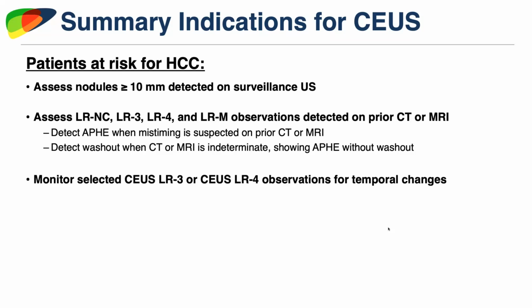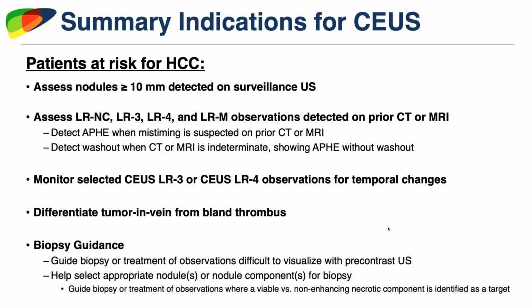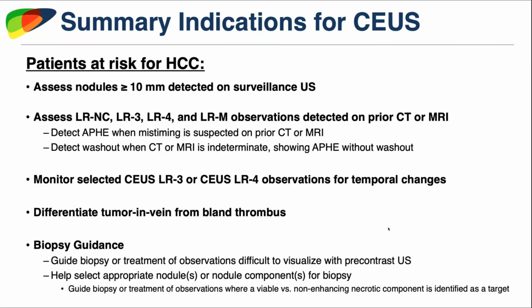So again, in a patient who has tenuous renal function or breathing difficulties or metal in their body, you can use contrast-enhanced ultrasound to follow an observation as opposed to another modality. We'll touch briefly on its use in differentiating tumor in vein from bland thrombus, and as I said earlier, using it for biopsy guidance and other interventions.